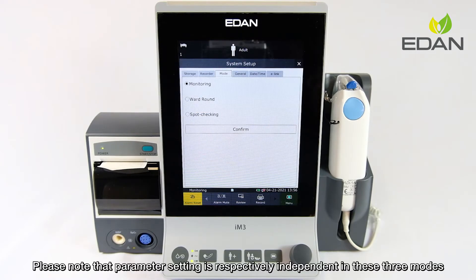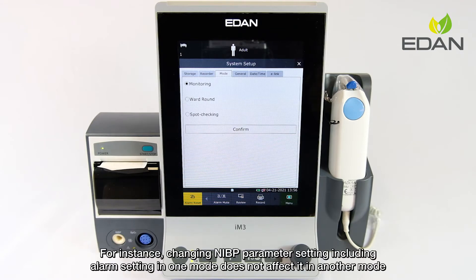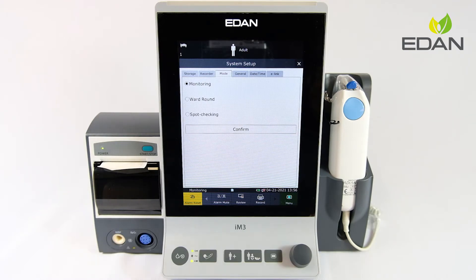Please note that parameter settings are independently configured in each of the three modes. For instance, changing the NIBP parameter setting, including alarm settings in one mode, does not affect the settings in another mode.